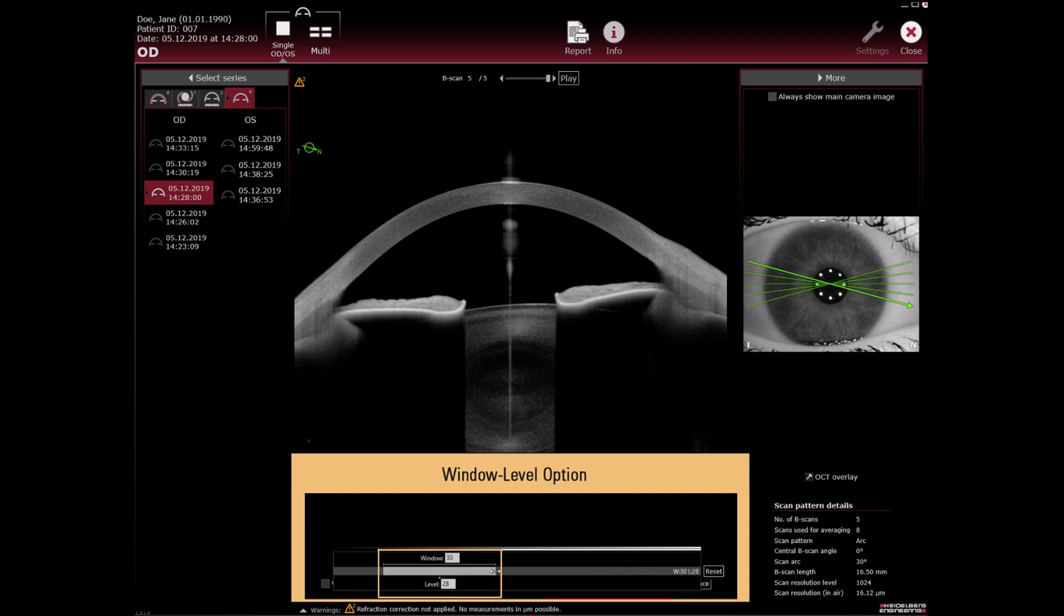Use window level option to receive similar image properties when comparing different series with adjusted window level. You can activate window level option in default settings.